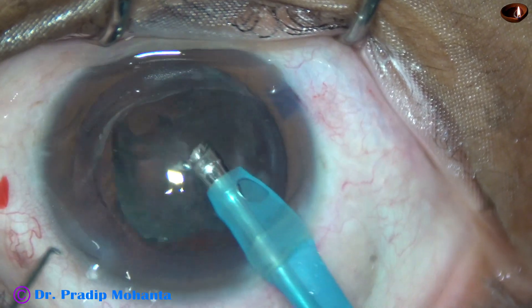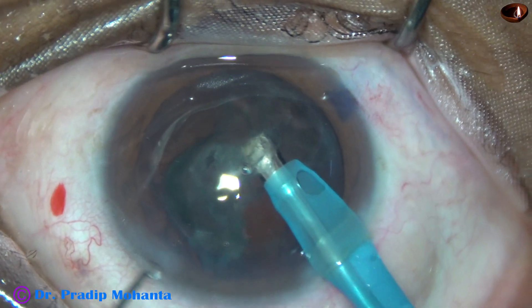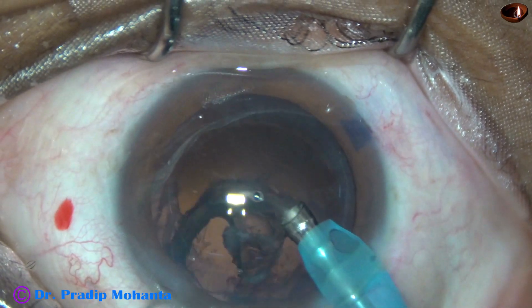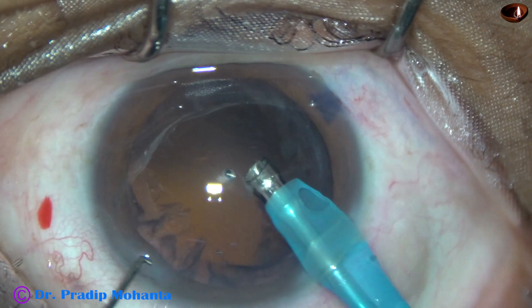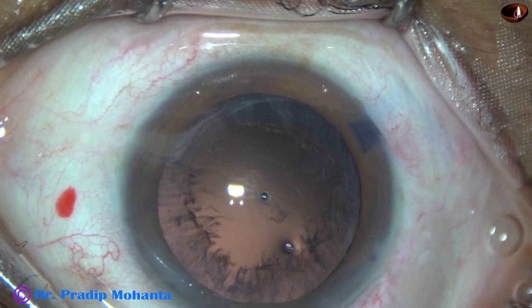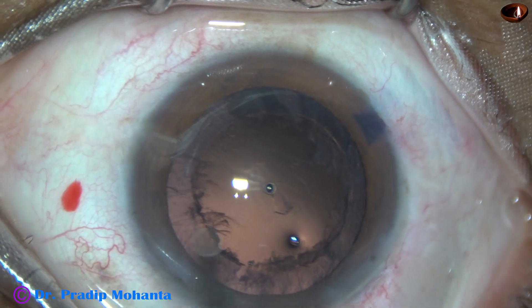And this is the epinucleus. At this time I am in phaco mode 3, where the vacuum is 250 and flow rate is 25 ml per minute, and ultrasonic energy is only 40%. The nucleus and epinucleus have been nicely managed.